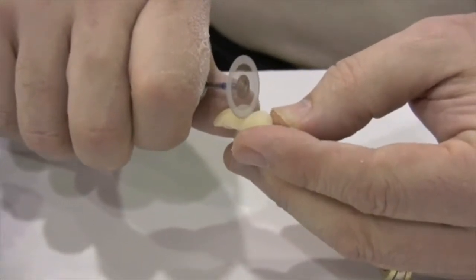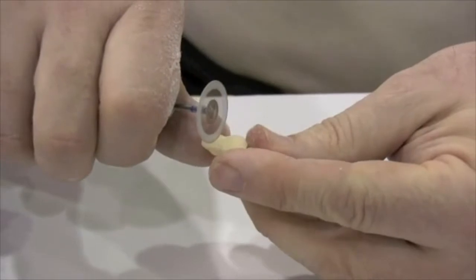Just to give a little bit further differentiation of the single units in the temporary.